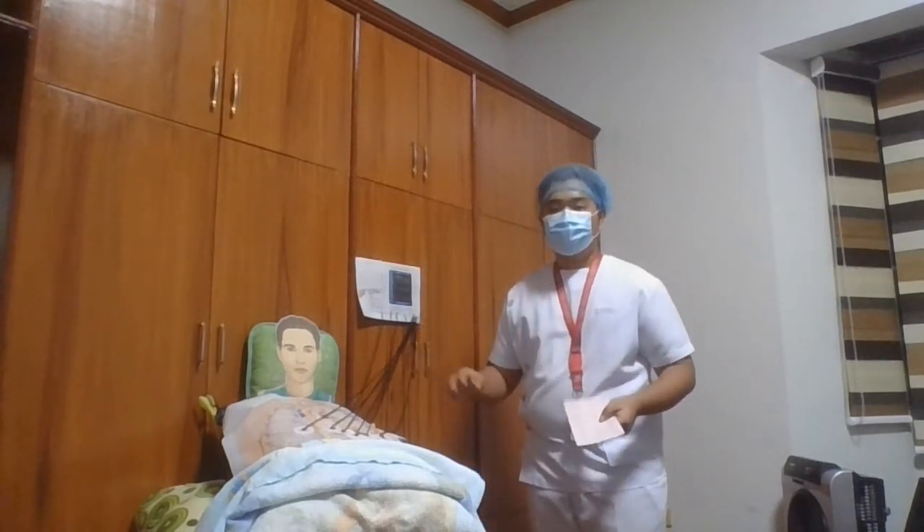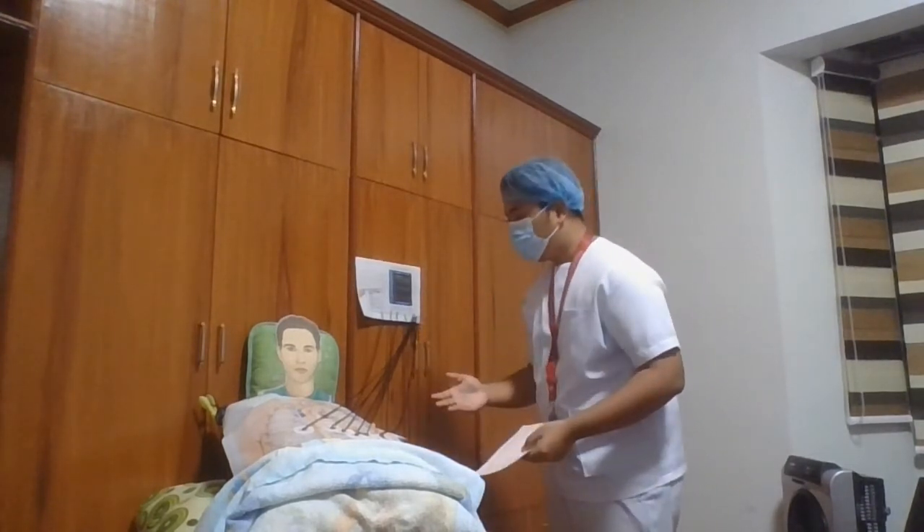And then afterwards, we're going to monitor the patient for comfort. Are you okay, sir? If our patient is okay, we will continue. Now, upon completion of the EKG, we're going to remove the cables from the electrodes and the electrodes from the patient's skin.